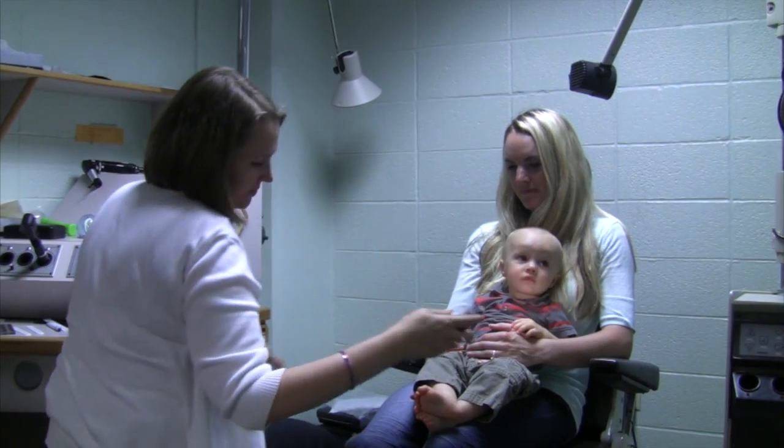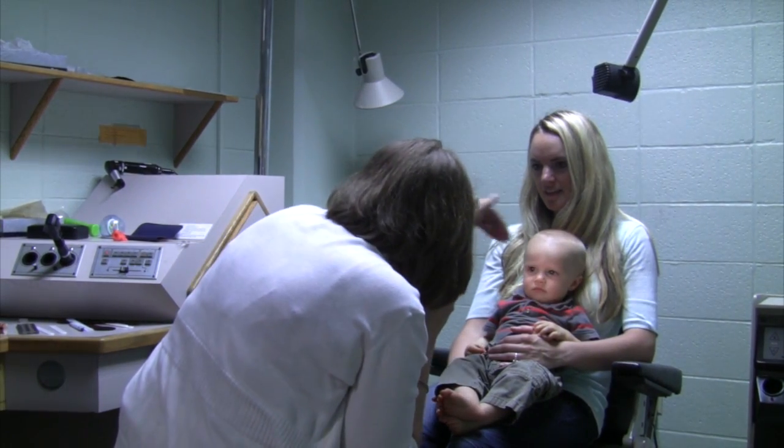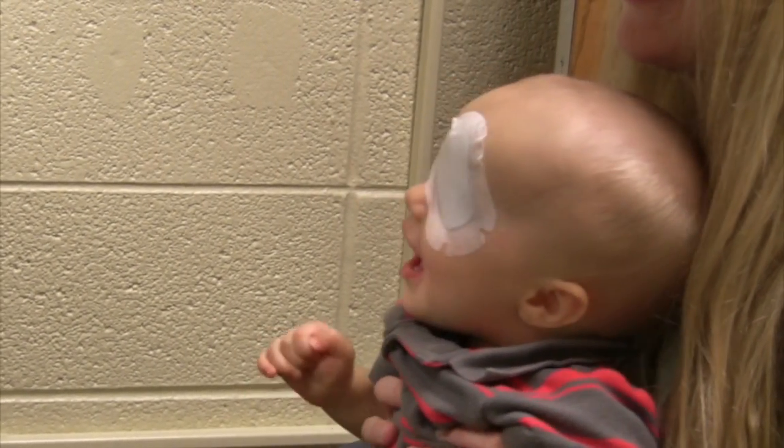We started off by checking his visual acuity. What we're looking for is either reduced vision in both eyes, or a difference between the two eyes where one eye is much reduced than the other. That's suspicious for amblyopia, which some people call lazy eye. That can be caused by a higher prescription in one eye, by an eye turn, or by some sort of pathology in the eye that's causing the reduced vision.